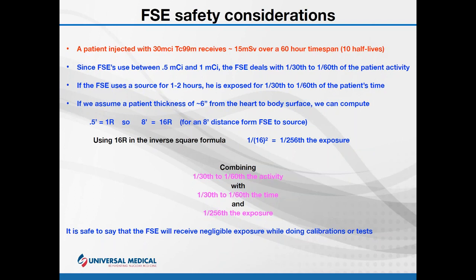Do I have to sit 1 foot from a source while it's calibrating, or can I sit across the room? We can limit our time with that exposure. I'm starting a calibration that's going to take an hour. Well, lock the door, go get a drink at the cafeteria, and I don't have to be there, so I can limit my exposure time.